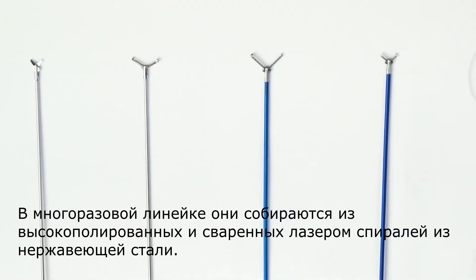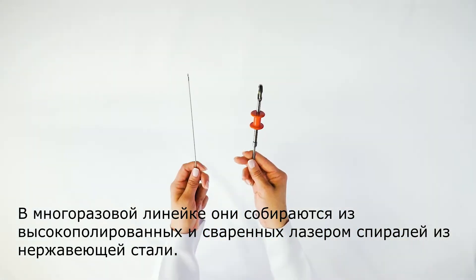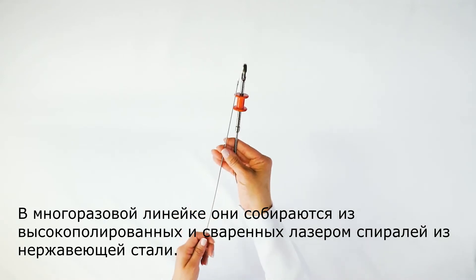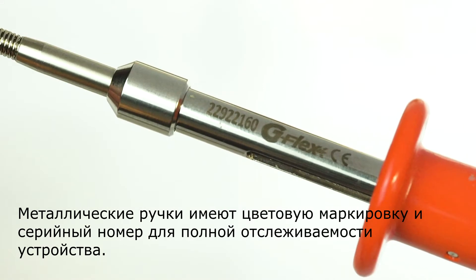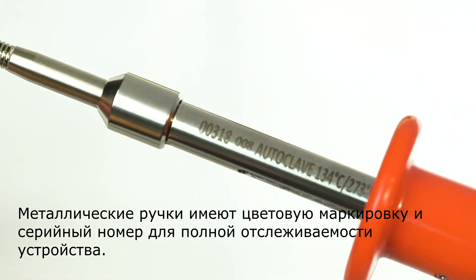In the autoclavable line, they are assembled with highly polished and laser welded stainless steel spirals. The handles are metallic with colored codes and serial numbers for complete device traceability.